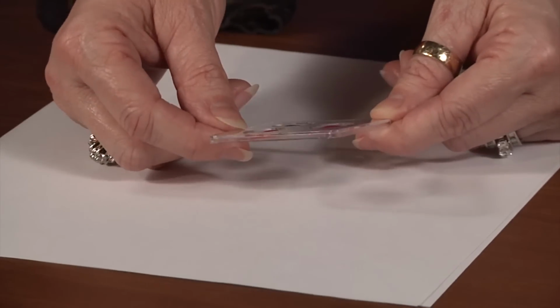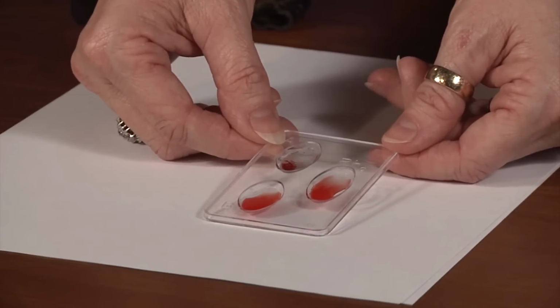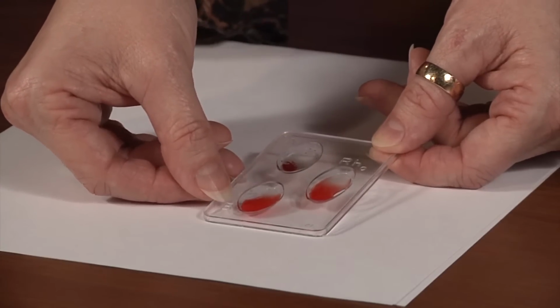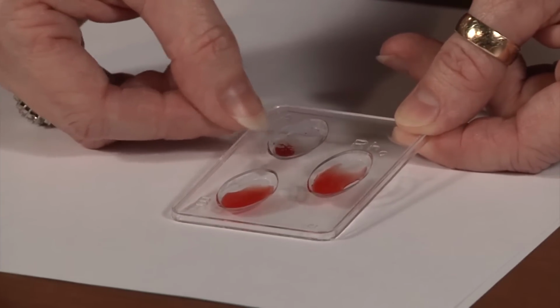In the well B, you can see that the blood is simply diluted. You do not have agglutination. So that tells you that there are no B antigens on those cells. We do have A antigens on the cells because we have agglutination.